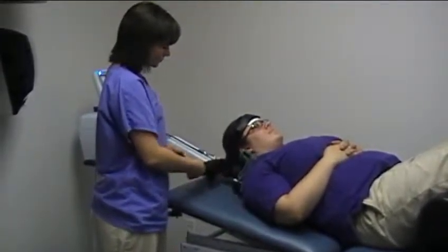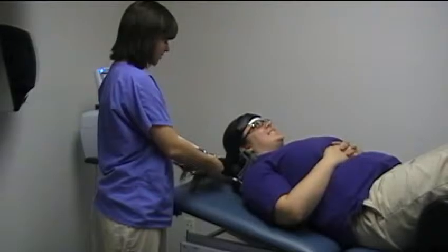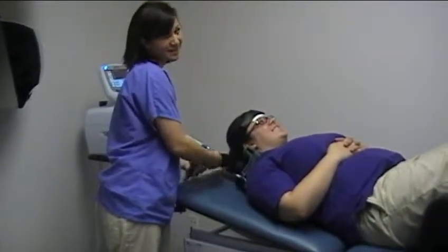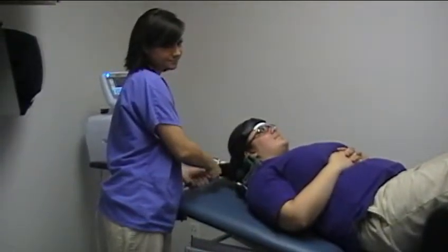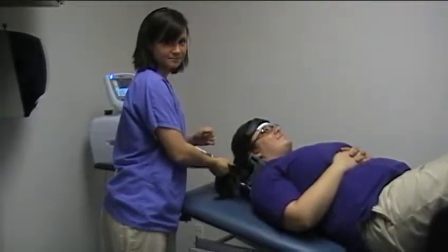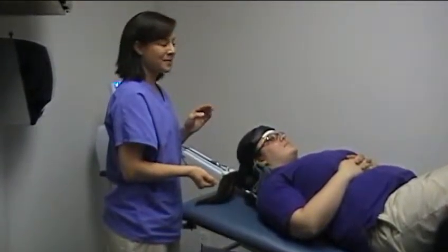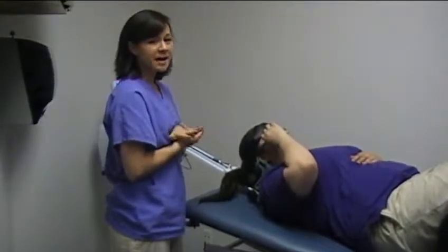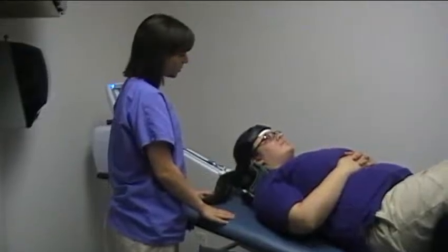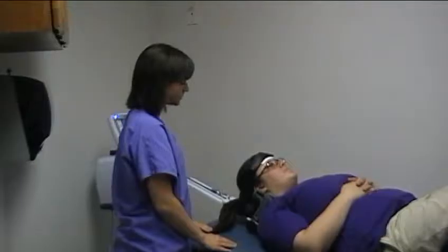Check with the patient: do you feel it pulling yet? Does it feel good? Once it gets up to the max pounds, ask the patient how it's feeling. Does it feel like too much of a pull? Is it hitting right where you want it, or would you prefer a little more?